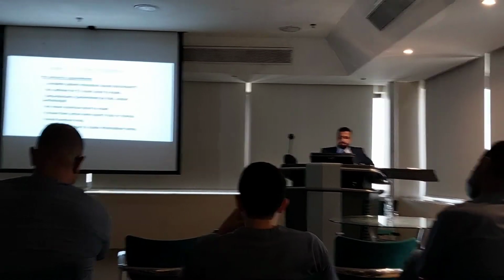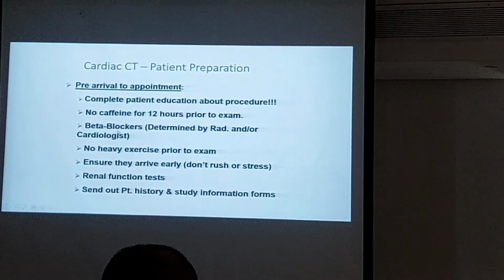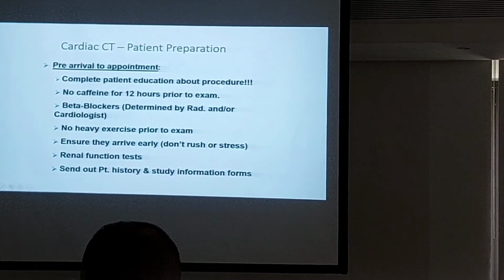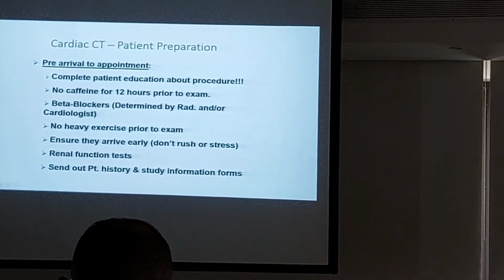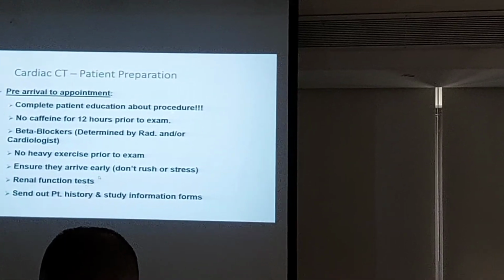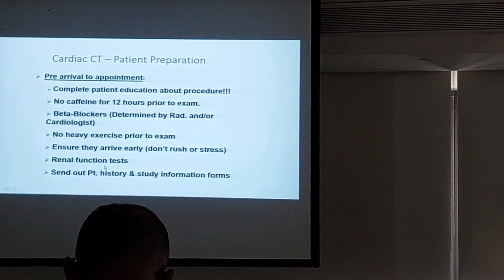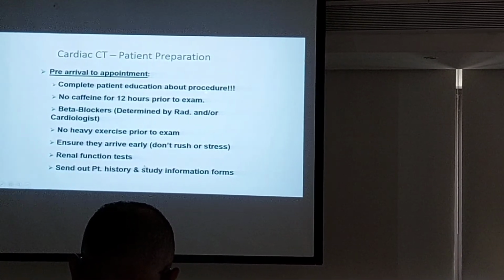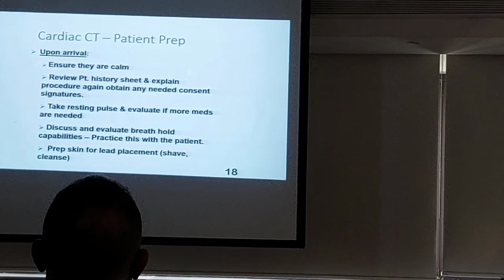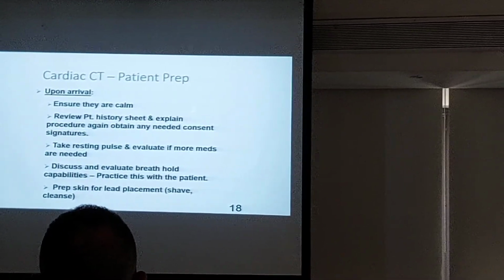No heavy exercise prior to the exam; this should be written. And even here, beta blockers are determined by radiologists and cardiologists. Both of them are doctors. So the radiologist, it's yours. Ensure they arrive early, and don't rush or stress. Renal function tests, definitely. Send the patient history and study information. Upon arrival, ensure they are calm, so discuss with them. Need to review the history and all the details.